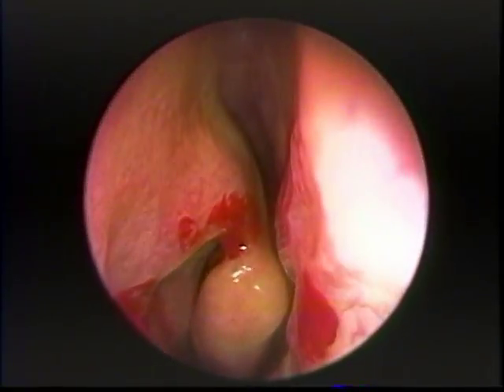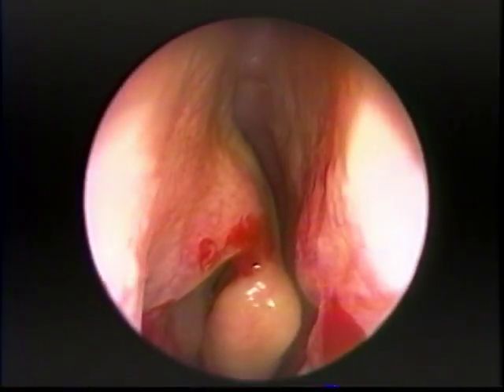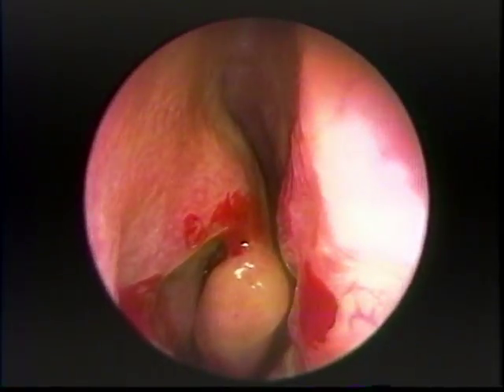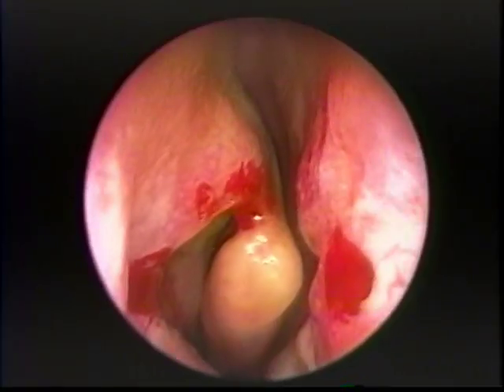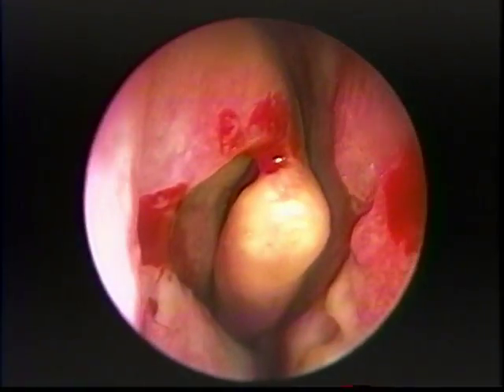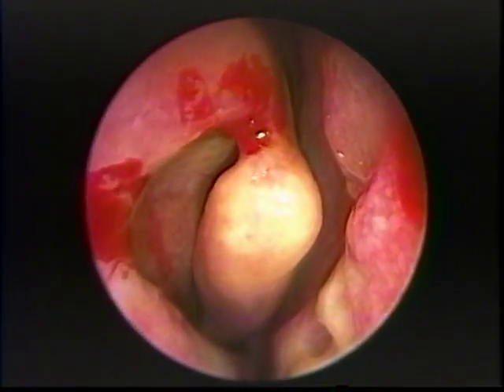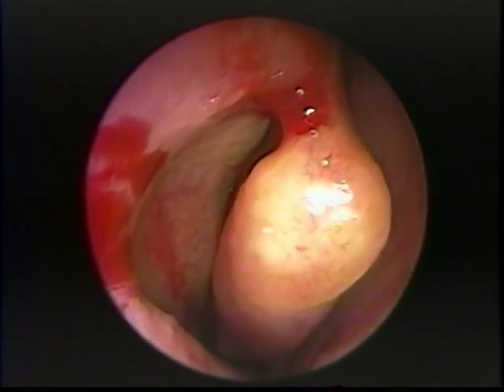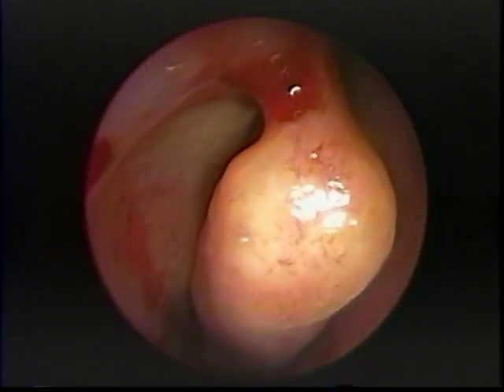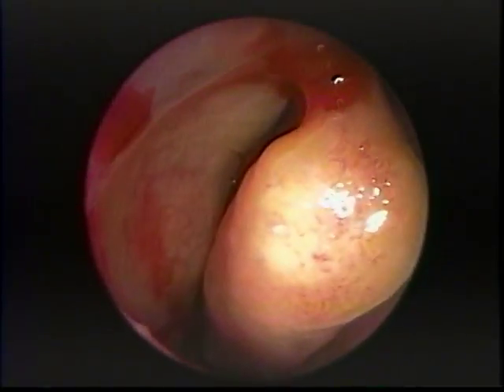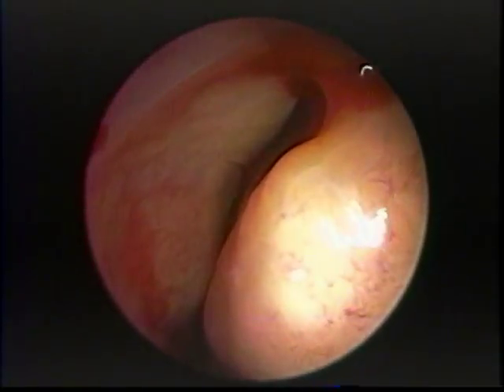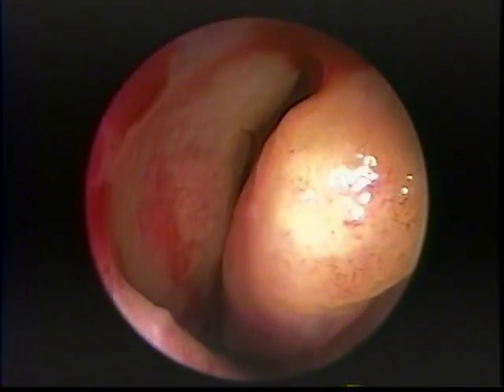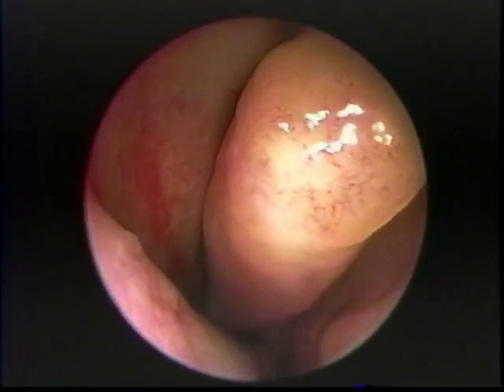Notice on this side the very prominent agger nasi mound, the widened head of the middle turbinate — which is not a concha bullosa — and a very large medially bent uncinate process, which is almost in contact with the lateral surface of the middle turbinate.